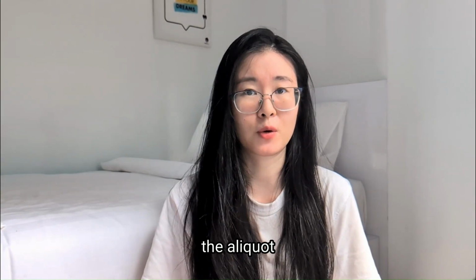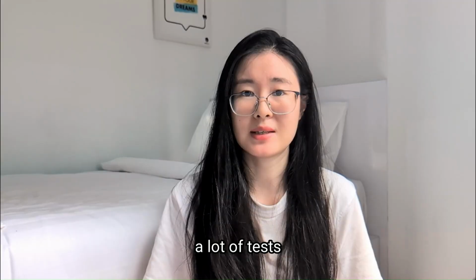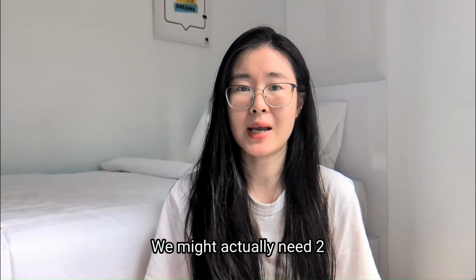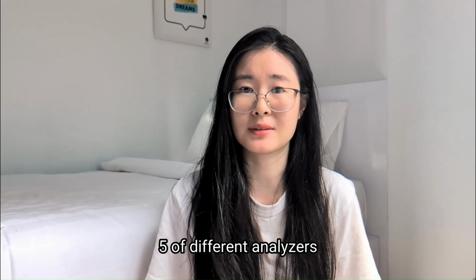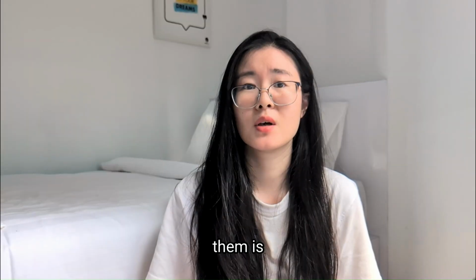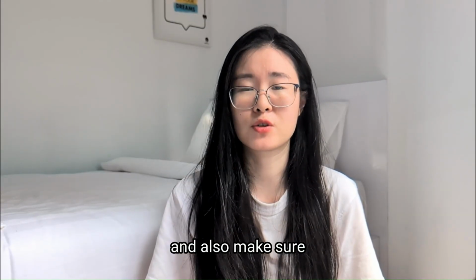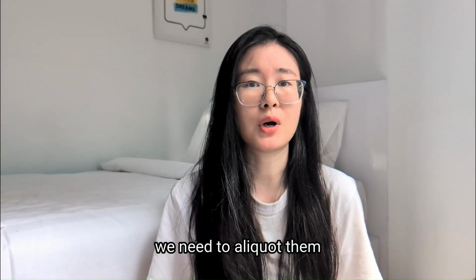Third, the aliquot. Especially in the chemistry department, a lot of tests cannot all be run on one big analyzer. We might actually need 2, 3, or even 4 or 5 different analyzers to finish everything you ordered. So, in order to give you a result as fast as we can, and also make sure the sample doesn't expire before we finish all the testing, we need to aliquot it.